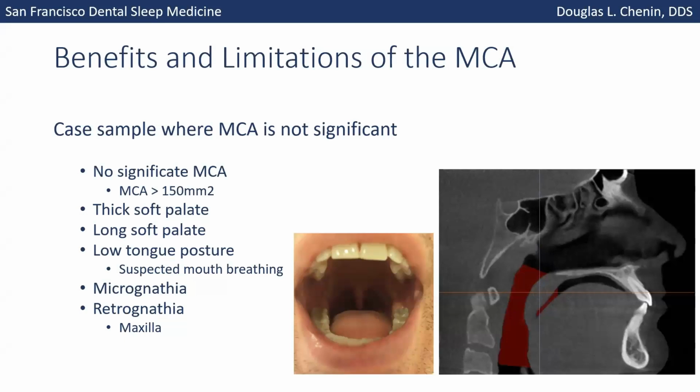Here's another one, the opposite, where the soft palate is pretty big, but the airway looks really big as well. This is sleep apnea. Still, it's kind of a really elusive case. And again, this is why we need the sleep studies and not just symptoms and reports from the patient. There was snoring and gasping and tossing and turning. If you look closely, the maxilla is a little bit inset. It's kind of like a subtle micrognathia, subtle retrognathia type of a case. And there are narrow arches, hard to see in this picture, but the maxilla doesn't fit well over the mandible.